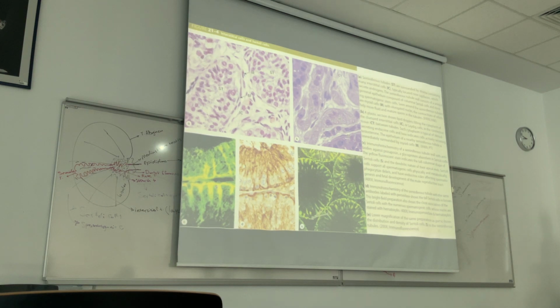Like which cells? In which cells do we have these foamy structures? In theca interna cells, in female reproductive system. In the cytoplasm of the cells of the cortex of adrenal gland, we have same structure cells.